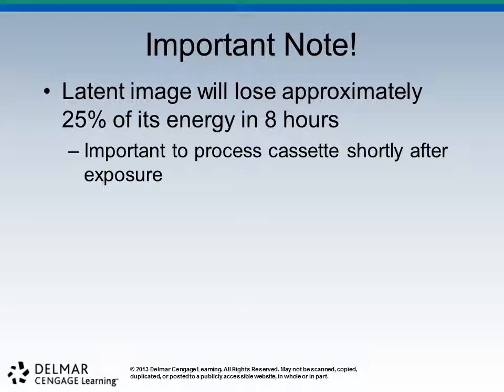Because they are electrons, they will first of all be charged and stuck in a spot, but over time, just naturally, they will come back to equilibrium. As they do, they lose that image recording data capability. So it's important within a couple of hours of exposure to go ahead and get them processed. Because after 8 hours, you've lost a quarter of your image data. Whether that means density or not, not really. It's just you've lost a quarter of your image data, which will translate into perhaps a noisy image.